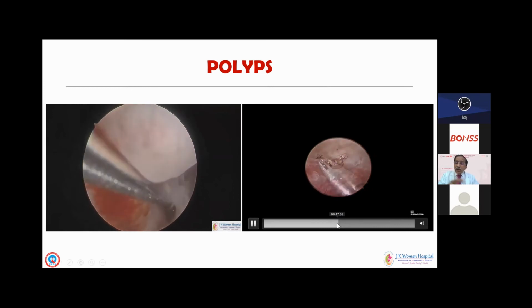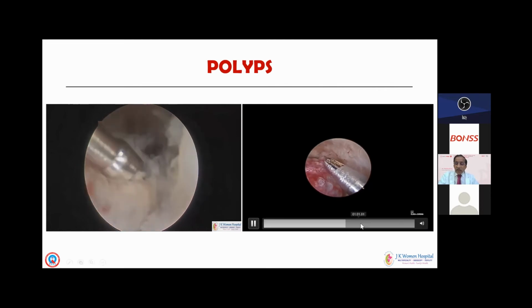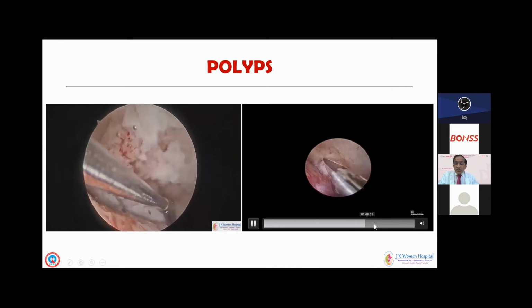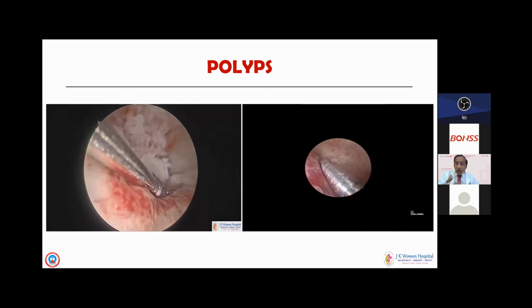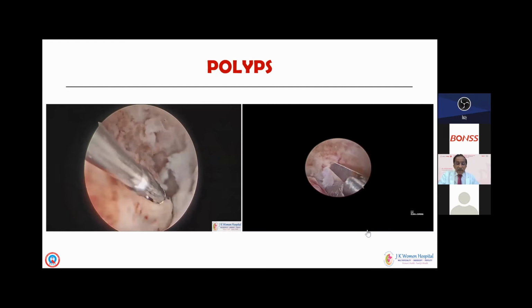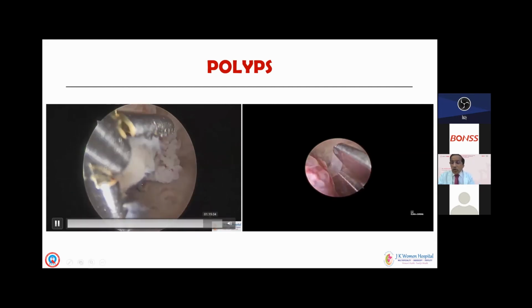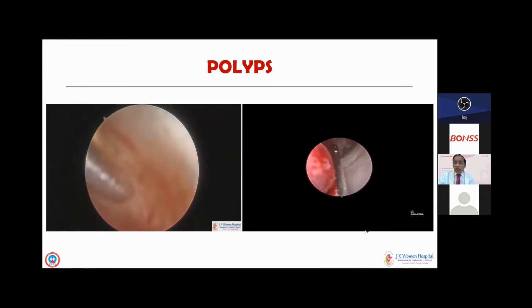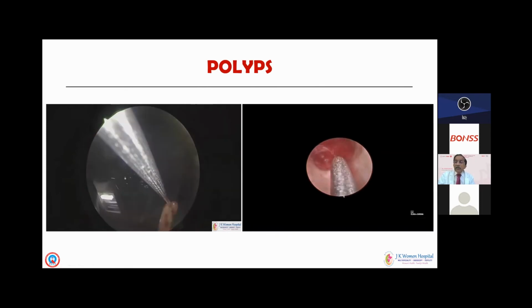and this sort of long polyp will very easily come out of the internal os, even if it is not dilated, and you can use a grasper to grasp it properly and then squeeze it out and bring it out of the canal. Well, if at all the polyp is big, you might use the electrode to lyse it and then bring it out, because polyps always have to be sent for biopsy. So this is the way of dealing with polyps, where we use it. You can see how beautifully you can grasp it and get it out of the canal and the external os.